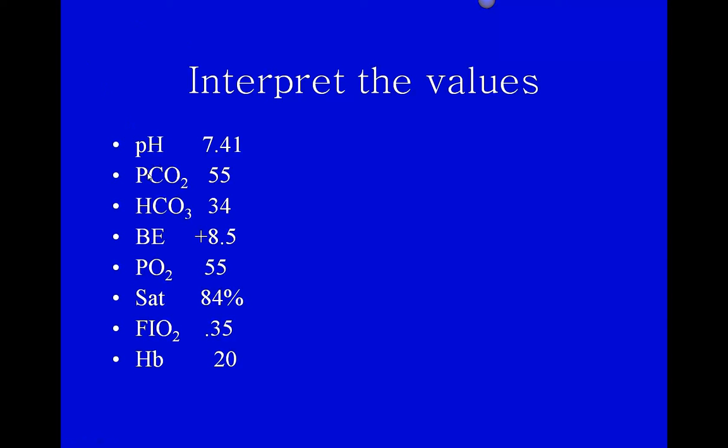So we'll have the person breathe shallower or take fewer breaths. And so the CO2 went up to try and compensate. Did it bring the pH back within its normal range of 7.35 to 7.45? Yes, it did. So I have a completely compensated, or fully compensated, because it brought it within 7.35 to 7.45, metabolic alkalosis.